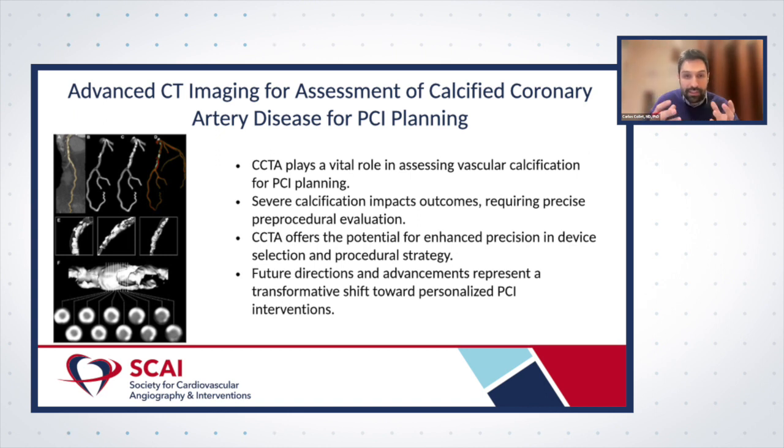So these are things that can be extracted from a non-invasive tool before the patient is in the cath lab, and allows you to prepare for what can be a complex PCI in the context of a severely calcified disease. So this is kind of the basics of the calcium analysis by CT.